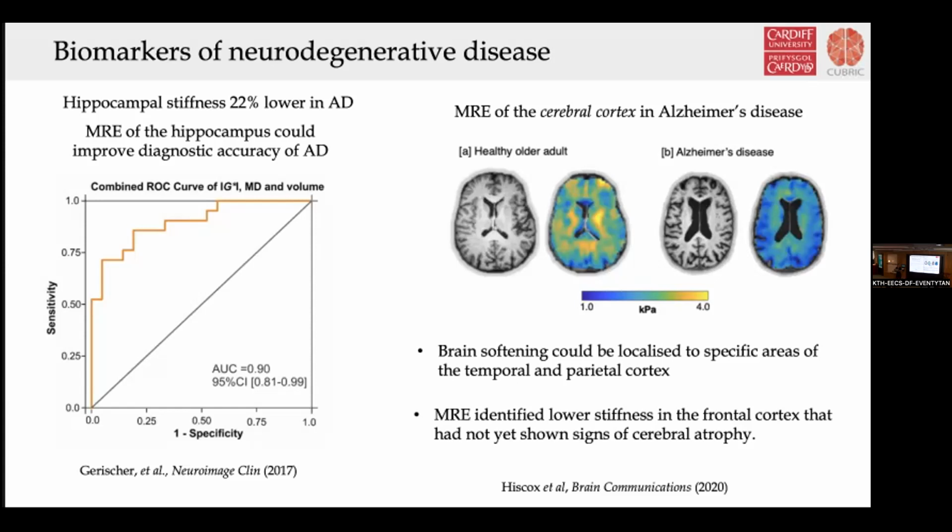So do the microstructure alterations observed by MRE precede the macroscopic volume loss? We don't know the answer to that question, but it shows promise for MRE to possibly monitor disease progression, but longitudinal studies are needed. I don't have time.